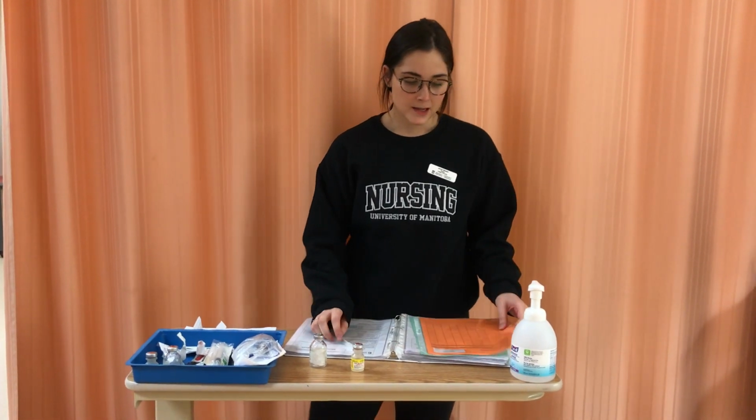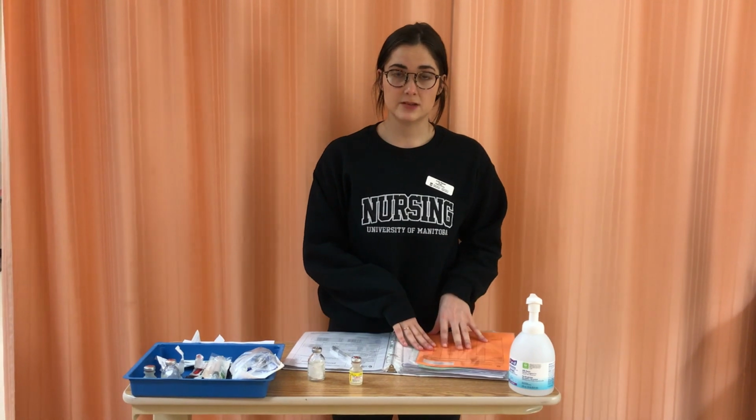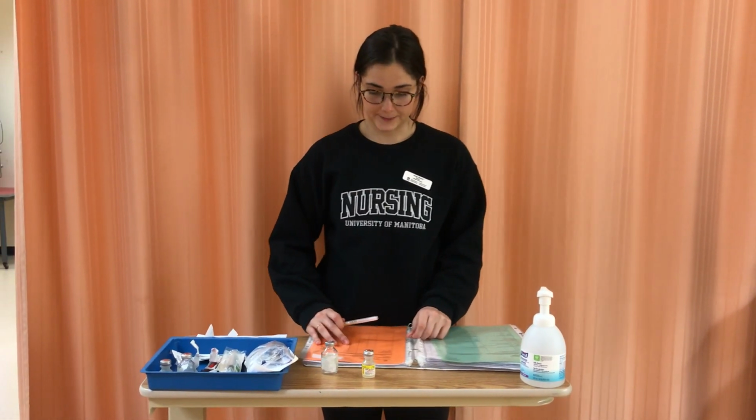I'm a student nurse, and today I'm going to show you how to administer a medication via a mini bag today. So we have our patient Frida Fritz. We've already confirmed that the doctor's order matches the MAR, so we can put the doctor's order away, and we're going to do our first check.